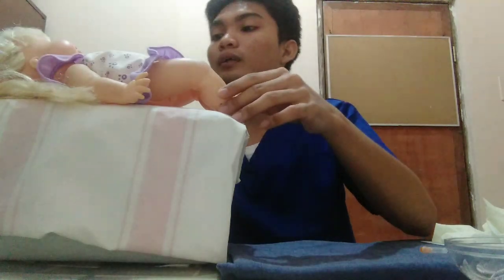So before doing the procedure, of course, we'll be asking the identity of the client and verifying the client's identity, as well as introducing ourselves. Okay? So, good morning po, ma'am. Ako po si Edmond M. Bigata, student nurse po ako from Camarines Sur Polytechnic Colleges. Ma'am, pwede ko po bang malaman po ang pangalan po ng baby?